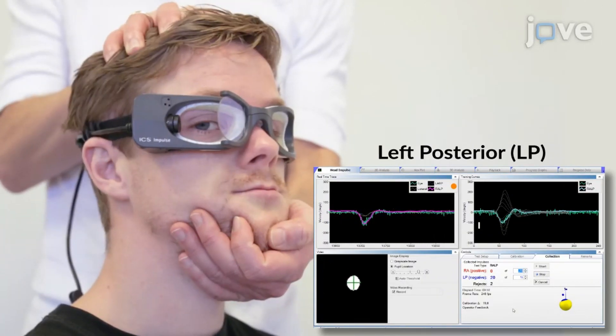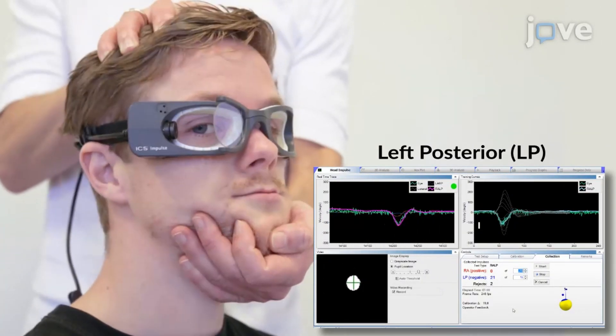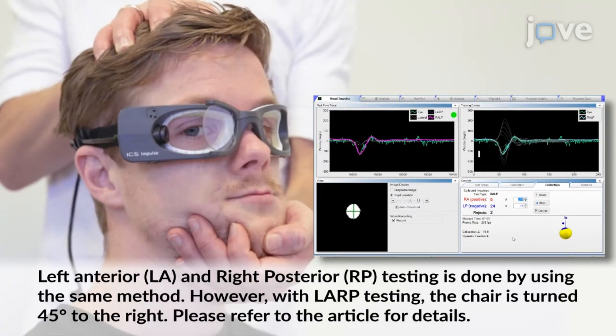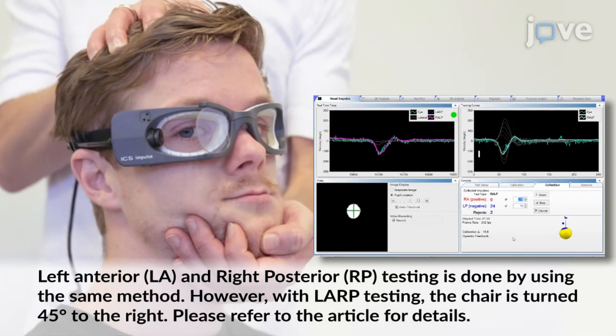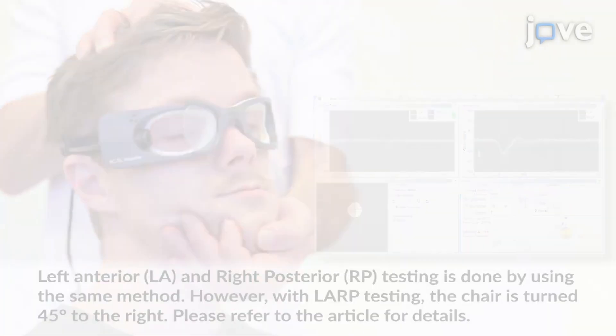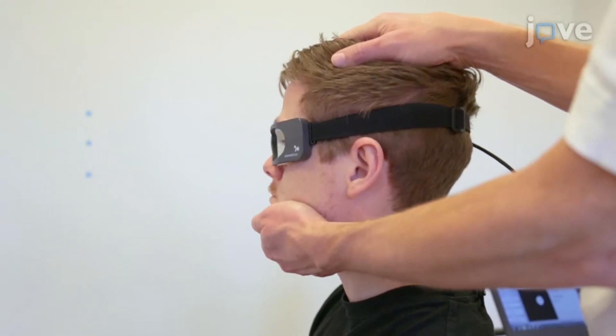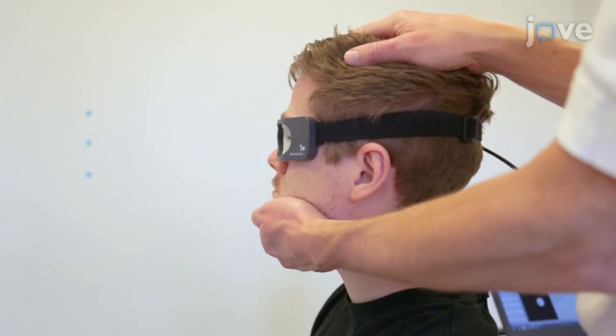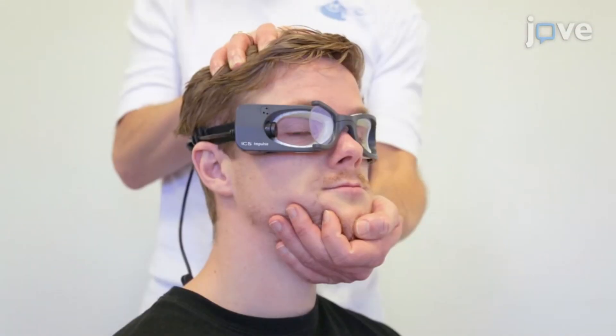Following that, for the posterior SCC testing, rotate the participant's head backwards in the pitch plane perpendicular to the wall. In summation, rotate the participant's head forwards in the pitch plane perpendicular to the wall for anterior SCC testing, and then backwards in the pitch plane perpendicular to the wall for posterior SCC testing.